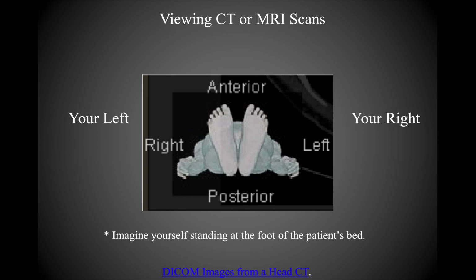So we talked about the PACS system before, which is where these things are stored, and then DICOM is the file format that's used for these medical images. So you can basically think of CT as a set of serial slices through the body, just like a series of slices through a loaf of bread.